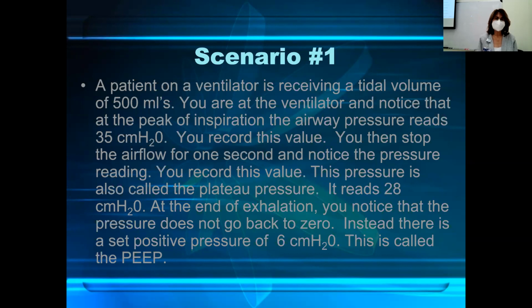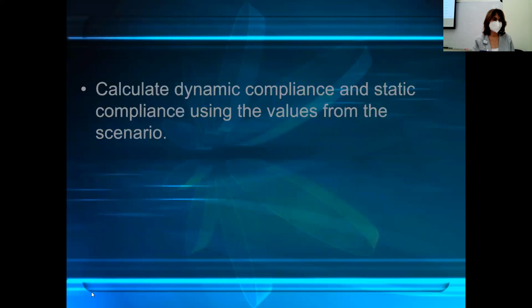At the end of exhalation, you notice that the pressure does not go back to zero. Instead, there is a set positive pressure of 6 centimeters of water. This is called the PEEP. So that's our scenario, and we need to calculate dynamic compliance and static compliance using the values from the scenario. I'll give you a couple minutes to do that, and then I'm going to call on people for the answer.